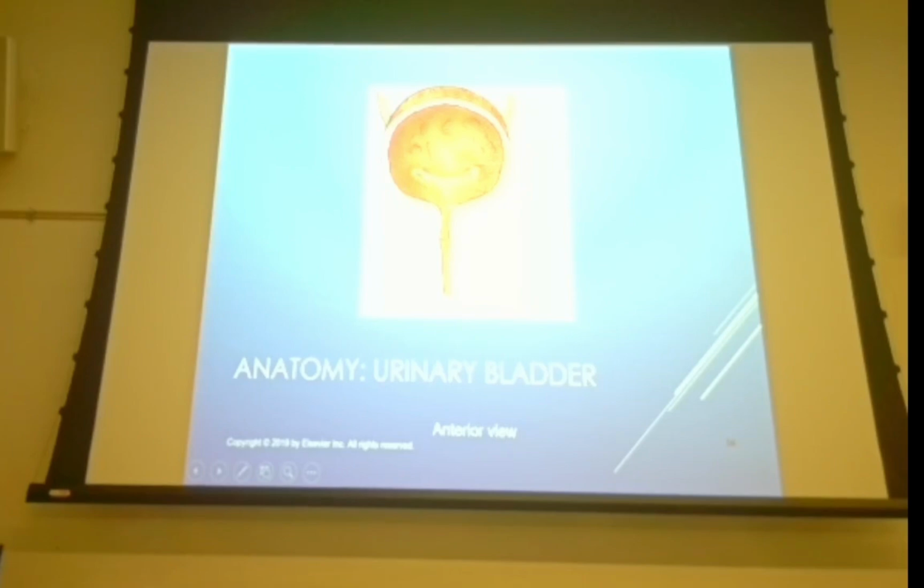So you've got your urethral opening here, ureteral openings here. If you haven't been to surgery yet, you will go to surgery. One of the things we do in surgery is a cystogram, where they go in and look at the bladder. They'll do a cystourethrogram, where they'll cannulate or put some sort of catheter right at the opening of the ureter. I said ureterogram, ureterogram, and inject contrast all the way up into the kidneys, and that's what we call a retrograde pyelogram.